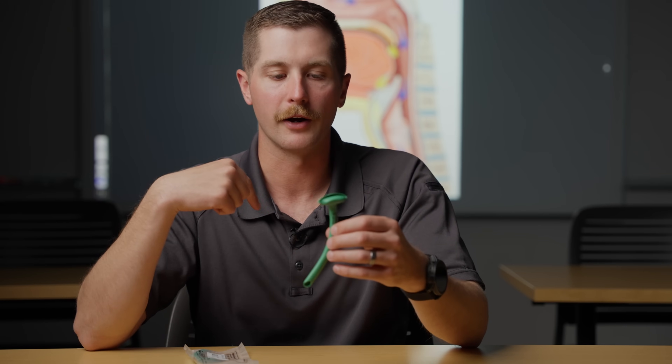Once we get it lined up, we're going to insert it directly into the nasopharynx. One of the mistakes I see people do is they try to feed it up and down, which is not actually how your nasal anatomy works. When you start to feed this into your nose, you want to go almost straight back — that's going to give you a much cleaner insertion. Also, if you hit resistance, the answer is not to force it further. All you should do is apply gentle downward pressure and rotate it slightly, and the majority of the time it will go back into their airway. If it just doesn't work, you can switch nostrils.